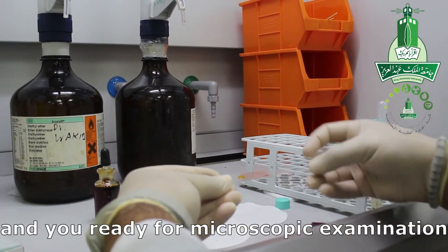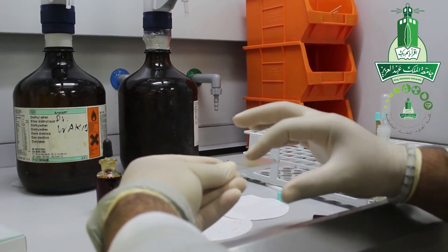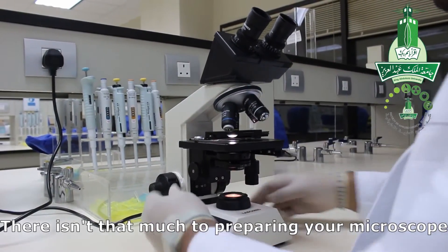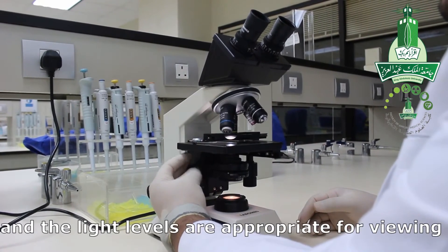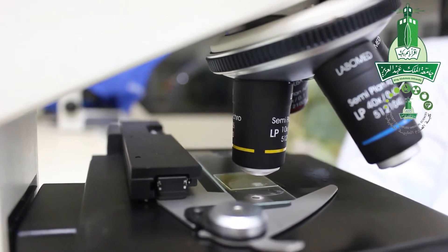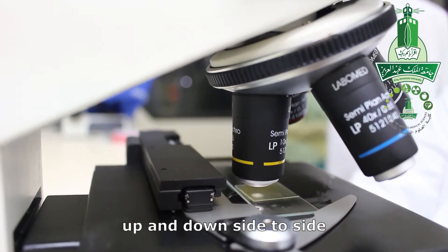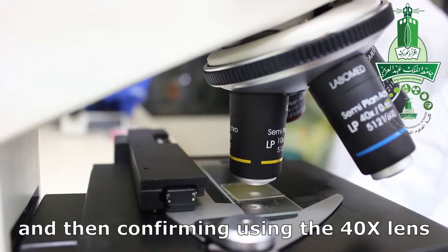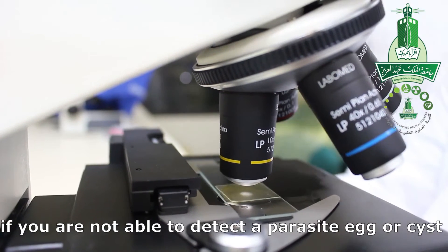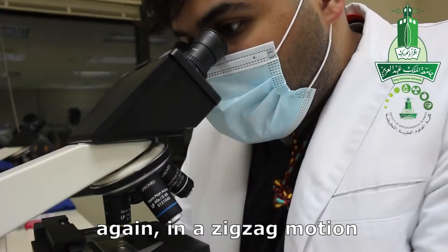You are now ready for microscopic examination. Make sure the light condenser lens and light levels are appropriate for viewing. Start the examination at the 10x lens, moving in a zigzag motion — up and down, side to side. You can then confirm findings using the 40x lens. If you are not able to detect parasites, eggs, or cysts, try again under the 40x lens, again in a zigzag motion.